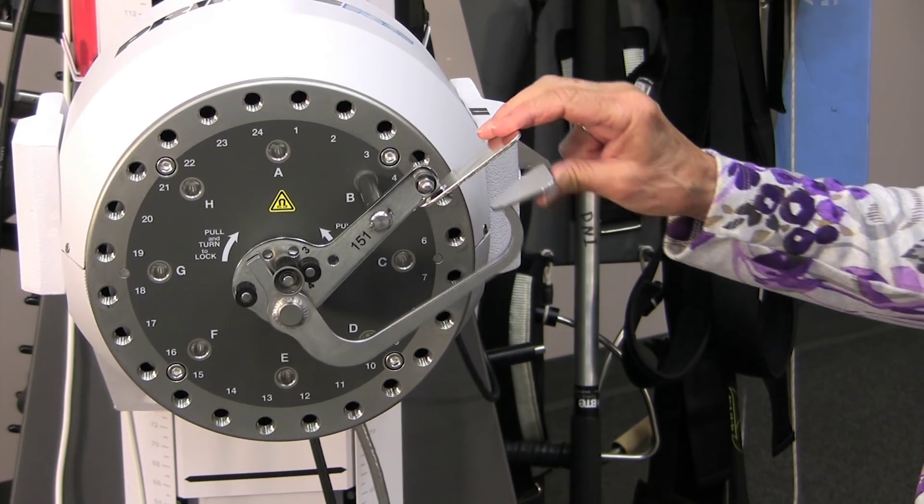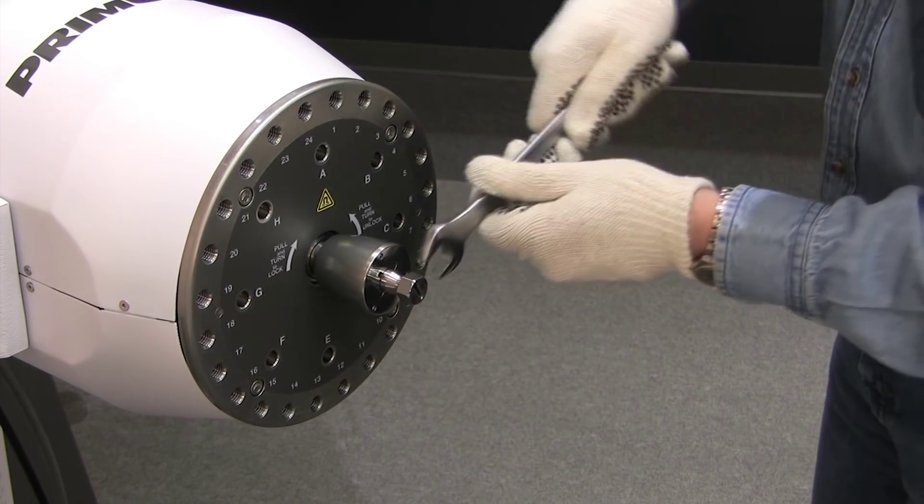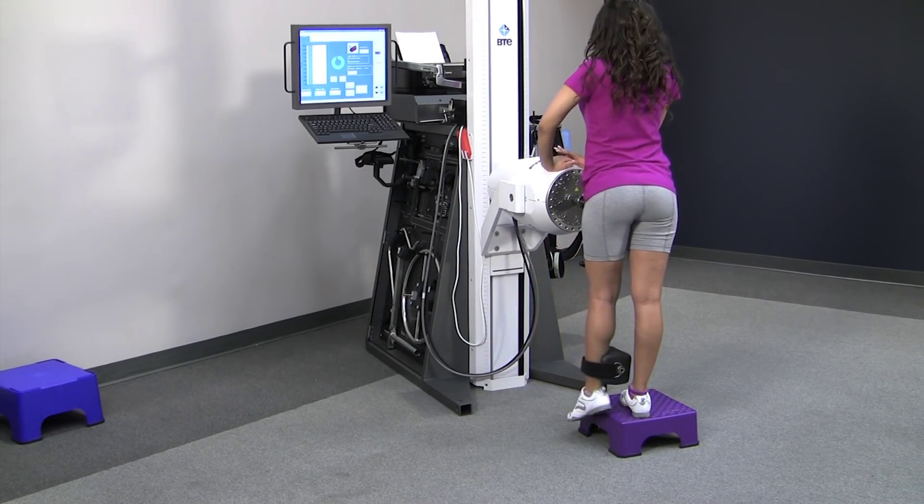Tool setups are limited only by your imagination. Gaining an understanding of the types of motions your patient has to perform will give you lots of ideas for appropriate setups.